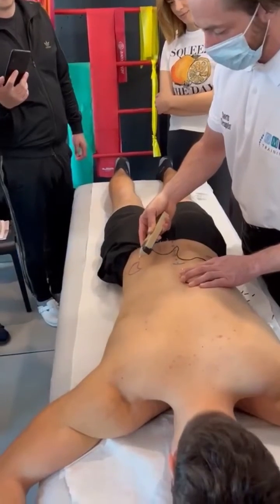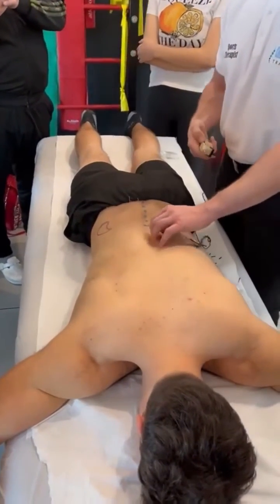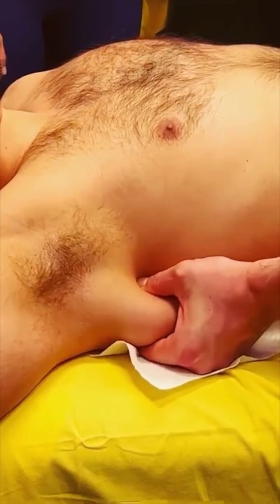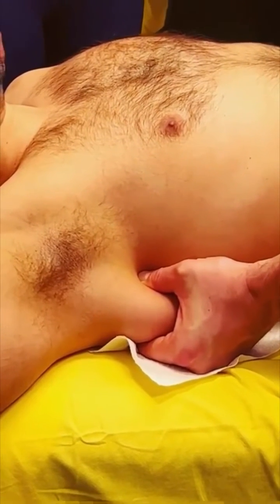And then if you want to palpate the scapula to get a good feel from where the subscap is — so now as I press down here I'm on top of the subscap fossa.